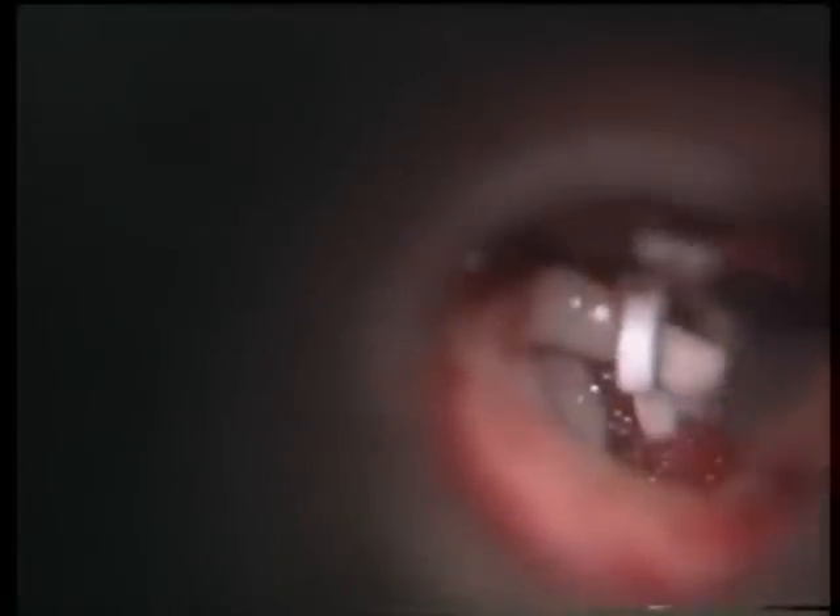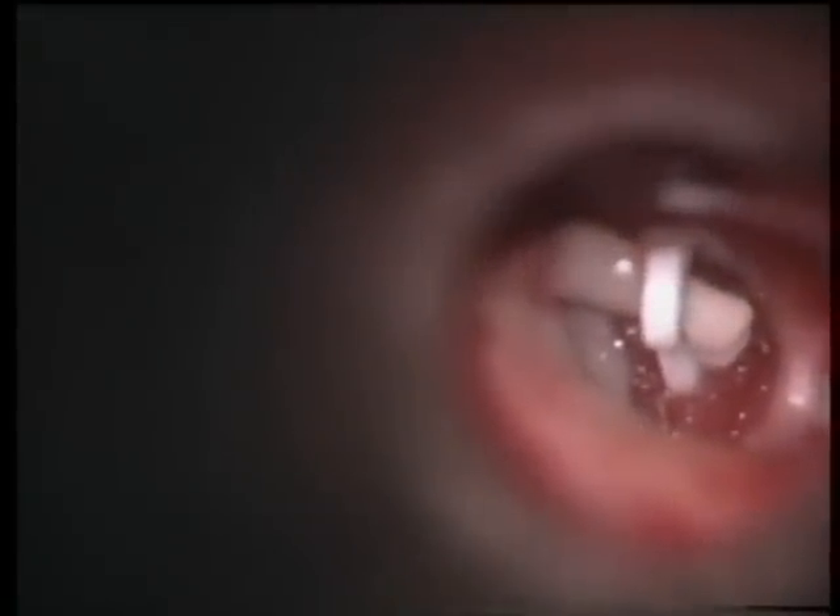We use a fine alligator forceps or a special crimping forceps for this purpose. The Teflon piston is tightly crimped and you can see its final position. The movement of the ossicular chain is being checked now, and you can see movement of the malleus bringing about a corresponding movement of the incus and the Teflon piston.